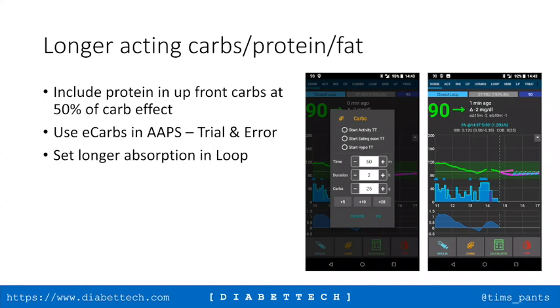Okay, thanks. Tim, I've just put a screenshot in there. I've always been a bit confused. When you come to use the bolus wizard, you've got the carbs on board, the bolus insulin on board, and the basal on board. Obviously, depending on which ones you tick and untick, it depends how much insulin it gives you. I normally leave the carbs on board ticked, but if that doesn't feel right, because you get a feel for things, don't you? I might change it to another one, but it'll change the amount of insulin it gives you.